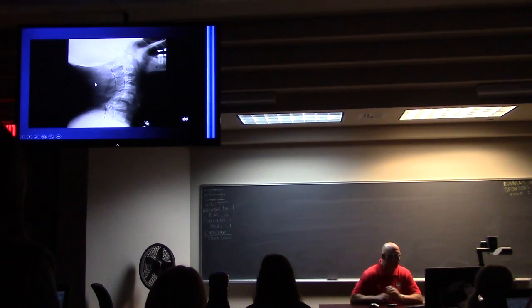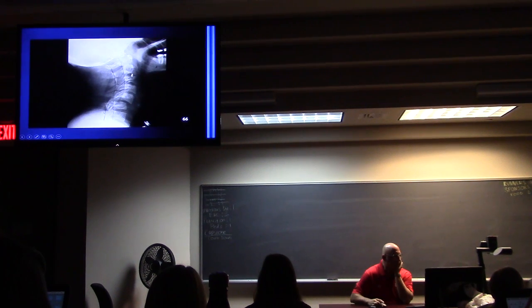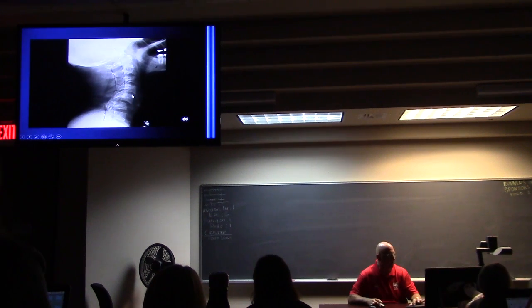Look at this one. Tell me what's wrong. First count, are there 7? All 7 are there. And what's the problem? Can you see it? What is it? 6 and 7. Okay. There's 2. It's got the nose on it. 2, 3, 4, 5, 6. So the posterior vertebral line is jacked up. The anterior vertebral line is jacked up. That's a fracture. You wouldn't want to miss that.